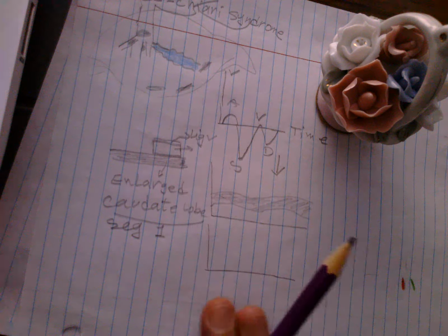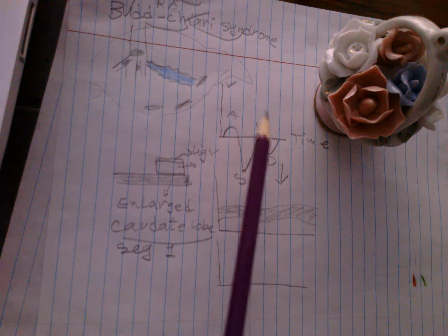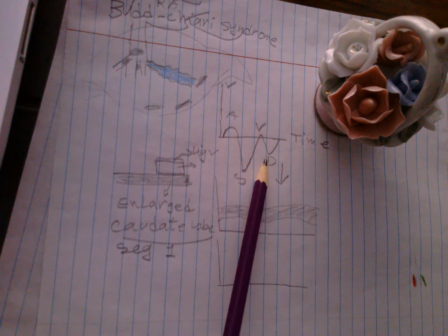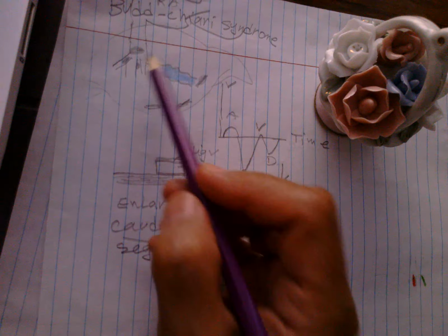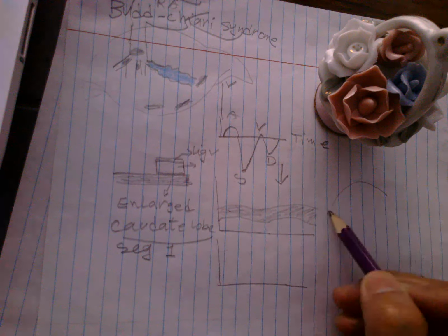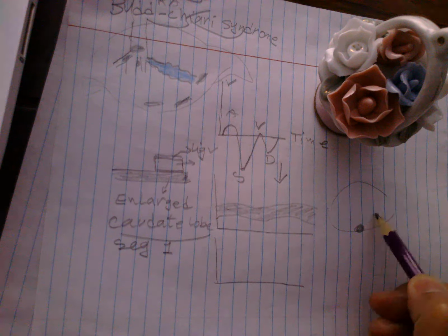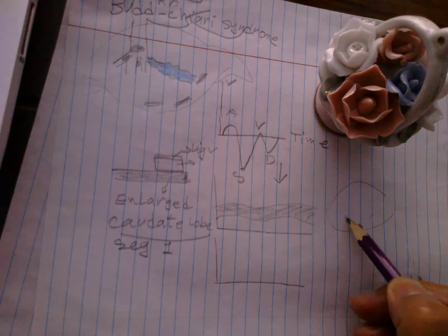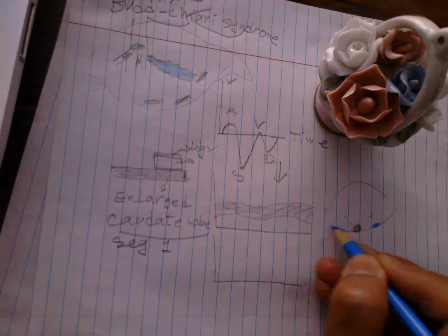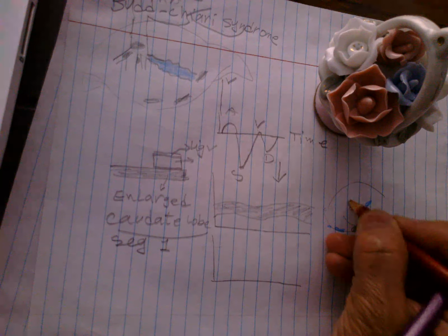We have the Budd Chiari syndrome here. With this one, we don't have any pulsatility, pulse wave, in spectral Doppler, in ultrasound or even gray imaging. We have the IVC here. We don't have any obvious hepatic veins. We have too many collaterals peripherally and centrally in any directions in color Doppler.